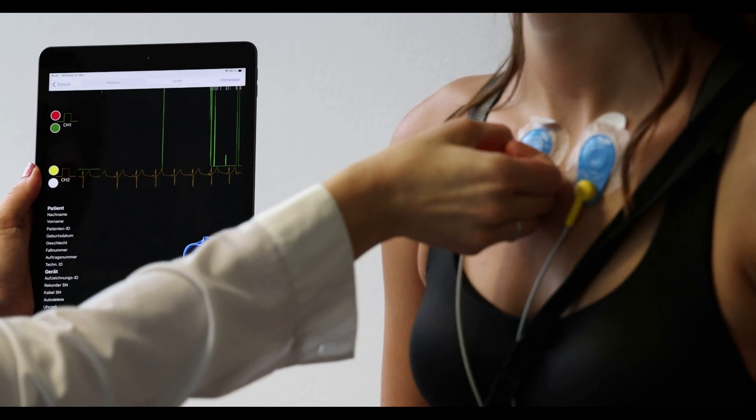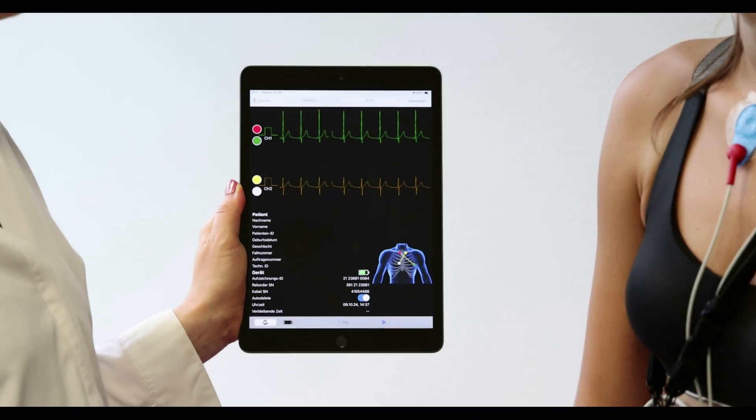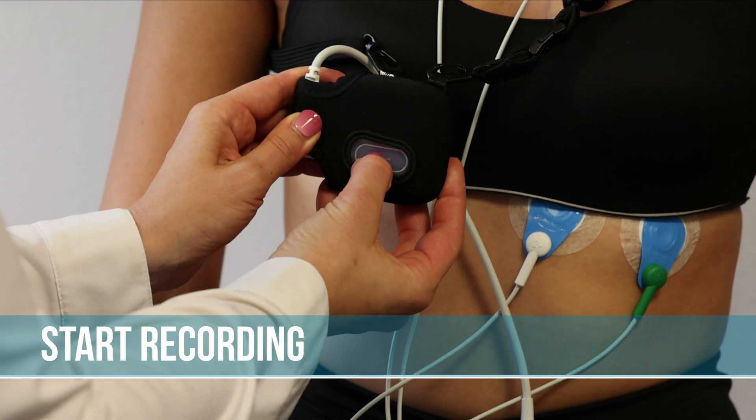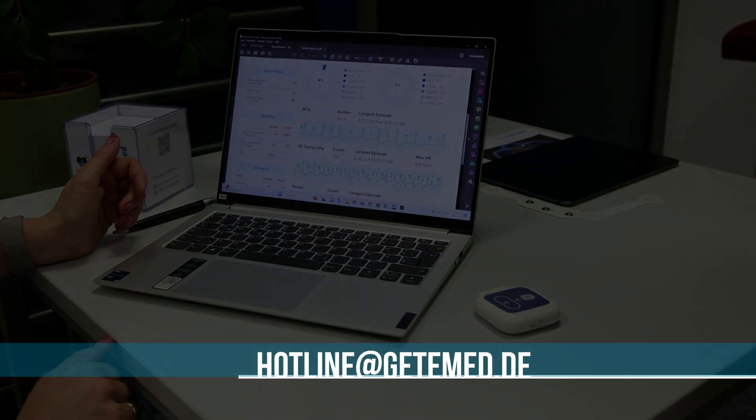When you have checked that the leads are correctly connected, ensure that the signal quality is high on all channels. Begin recording by pressing the button on the recorder. If you have any inquiries, please contact your local healthcare representative or email us at hotline@getemed.de.